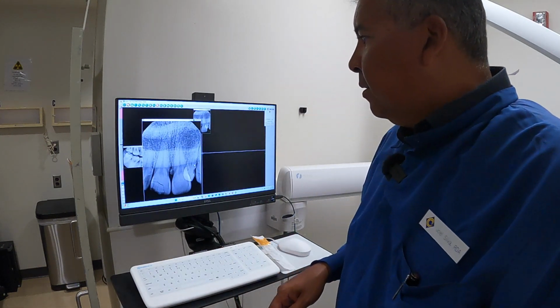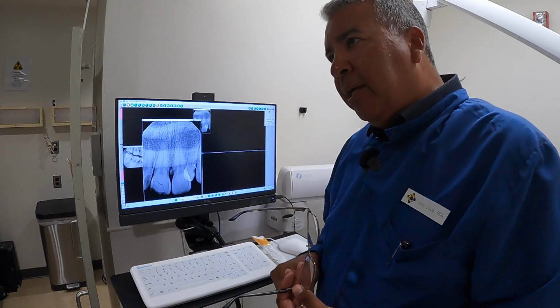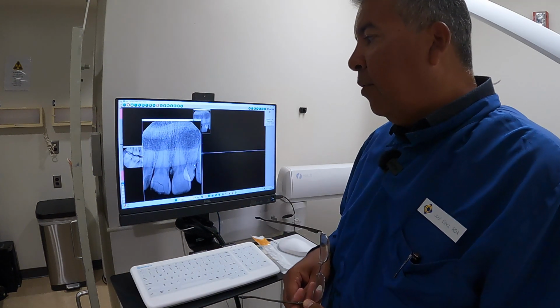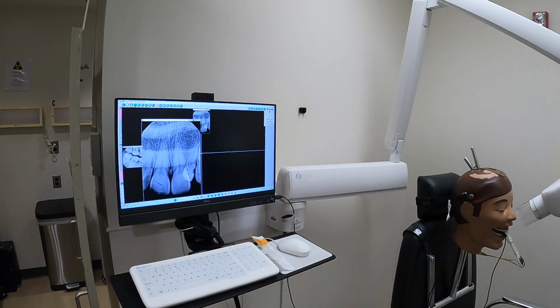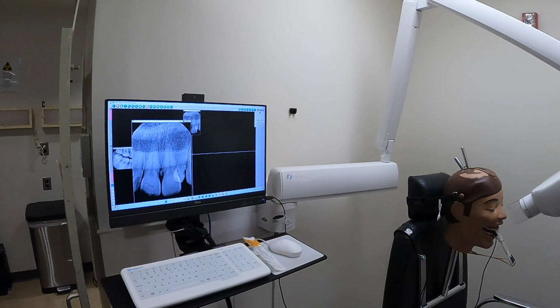Okay, so typically whenever you find the bisector and you go straight to it, it typically goes elongated in digital. I don't know why that is, but it does it. We got lucky right now, but here's what I typically say. Whenever you do digital, now is this PID positive or negative right now? Negative. I would say it's negative, right? Going from what you remember from last week, what determines if it's positive or negative?